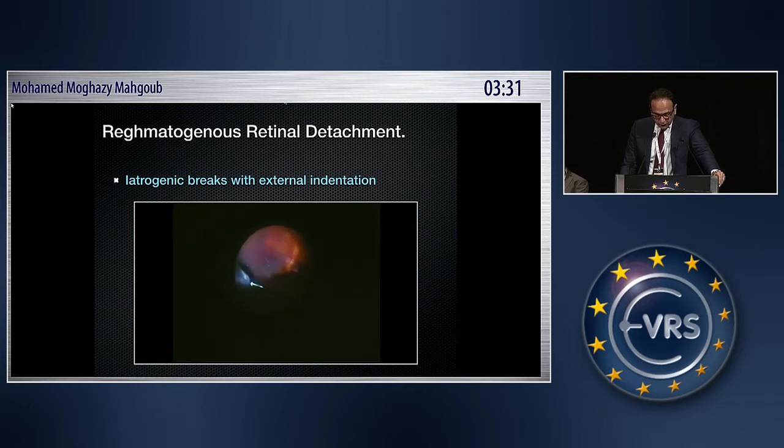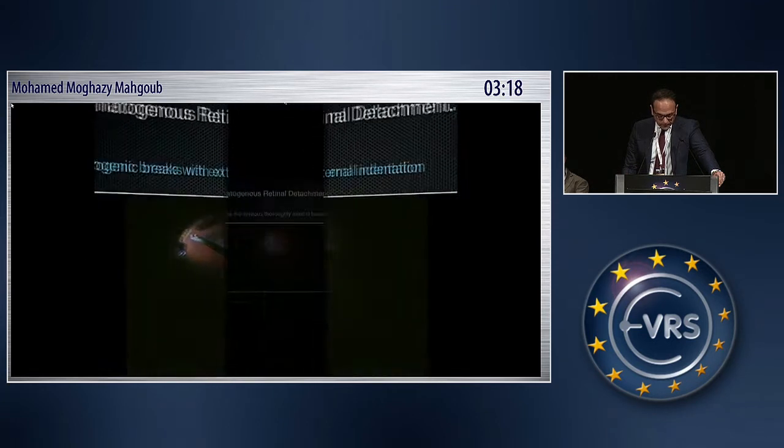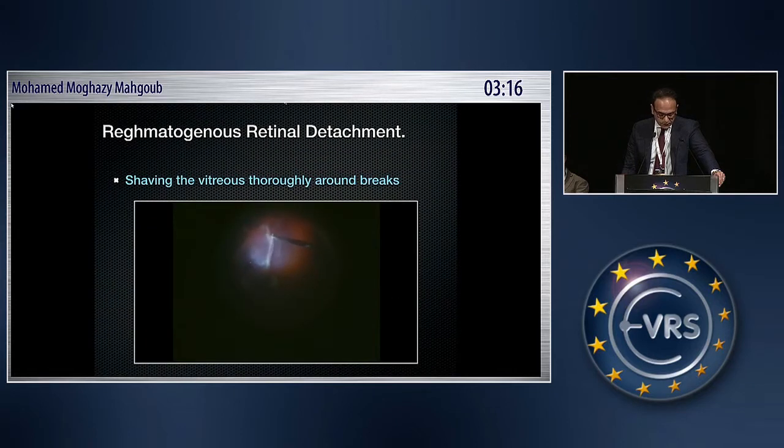This is the technique of external indentation — even in the most experienced hands, whether performed by the surgeon or a nurse, breaks can still be created. But with endo-indentation pushing the retina backwards with the air inside, it is safer. Even if a break forms, it remains contained.